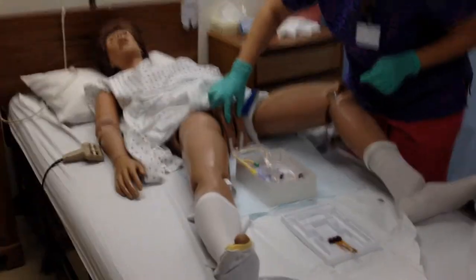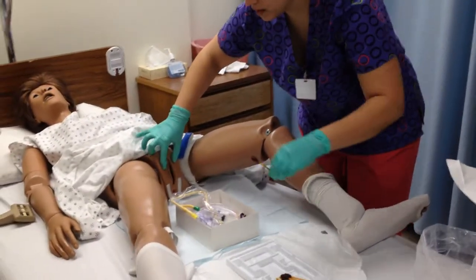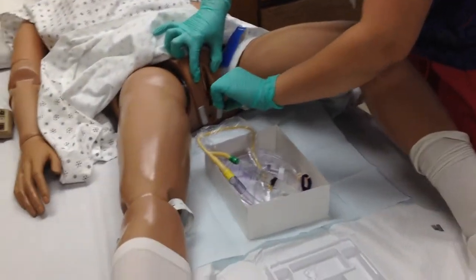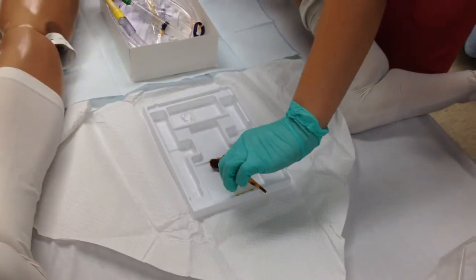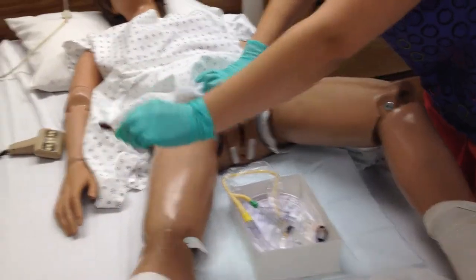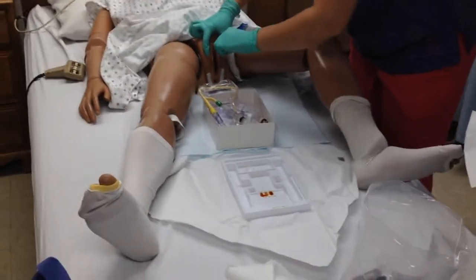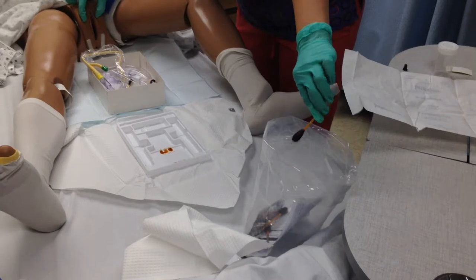I'm going to open the labia, take one betadine swab, I'm going to go on one side from front to back, then I go around my sterile field, put that in the garbage. And on the other side, front to back, go around my sterile field and throw it away. And one down the middle, front to back, go around my sterile field, throw it away.